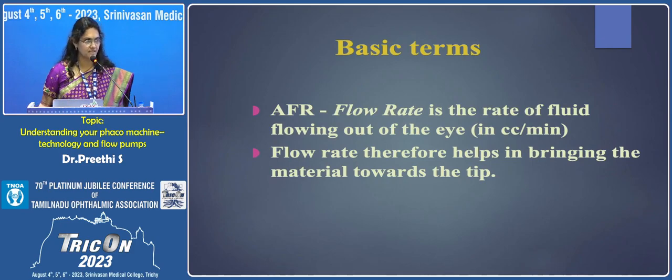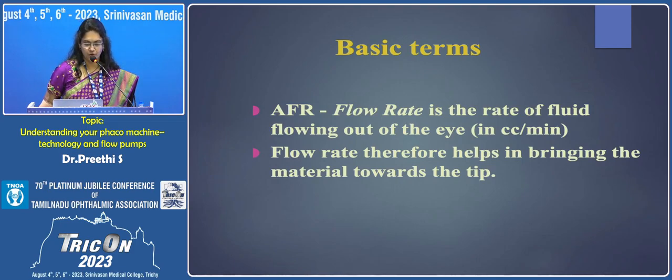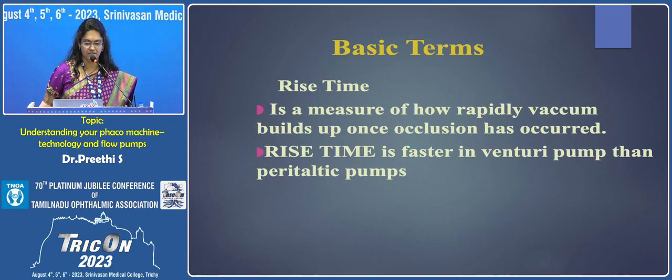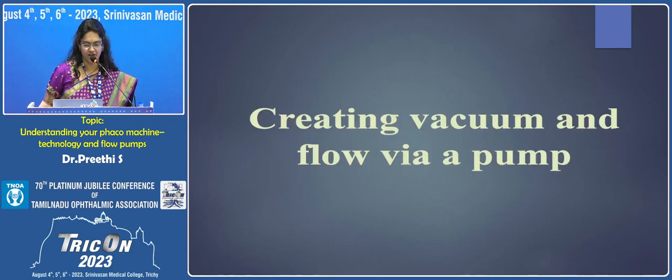These are the basic terms which we should know, which is called aspiration flow rate. It is the rate at which the fluid flows out of the eye. So flow rate helps in bringing the material towards the tip. And we should know what a vacuum is. Vacuum level is the difference in pressure between the atmospheric pressure and the pressure inside the aspiration tubing. So the vacuum helps in holding the material, and rise time is how quickly we can build the vacuum.